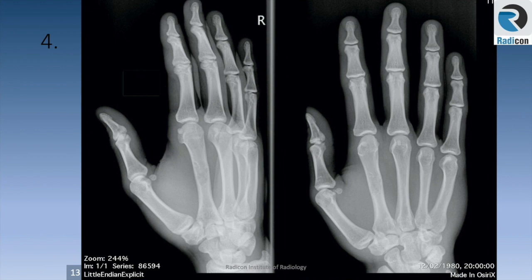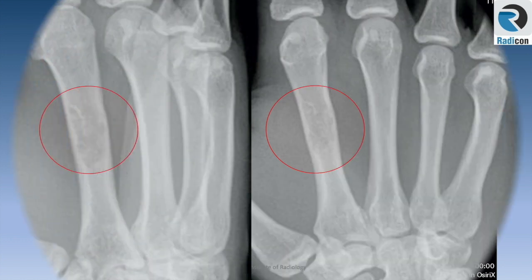Case 4 — first things first, let's zoom up. Zooming definitely helps when reviewing hand radiographs for subtle findings.